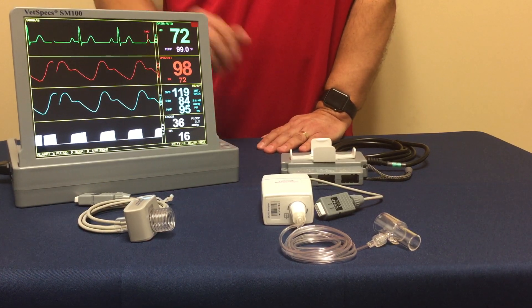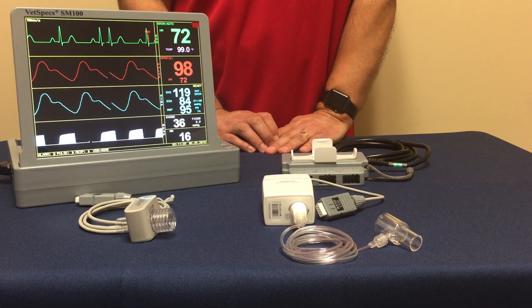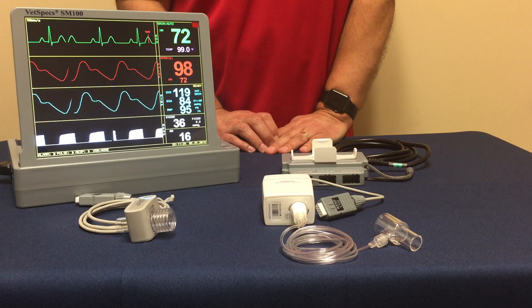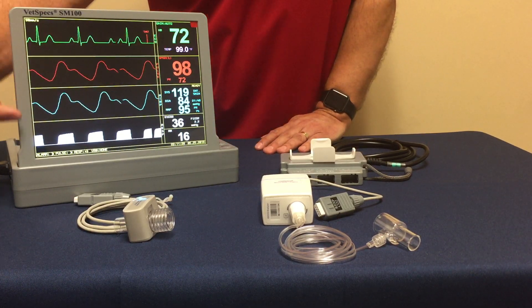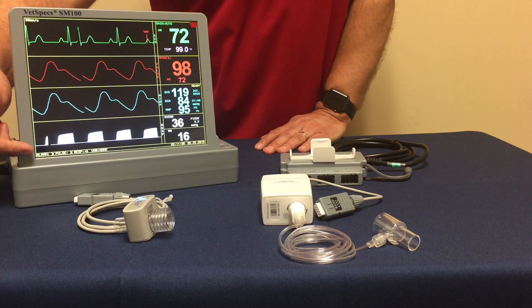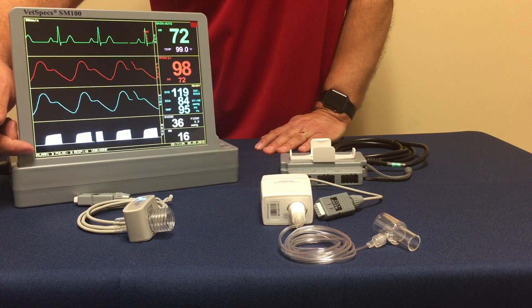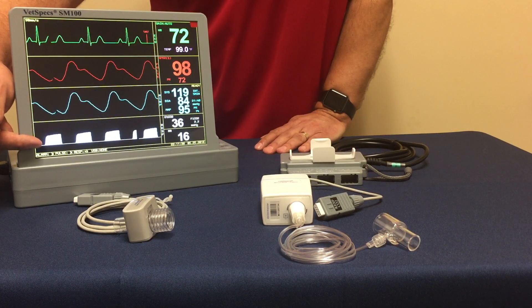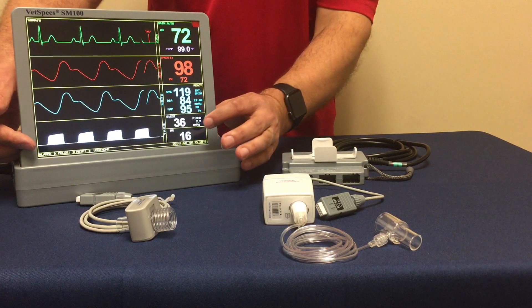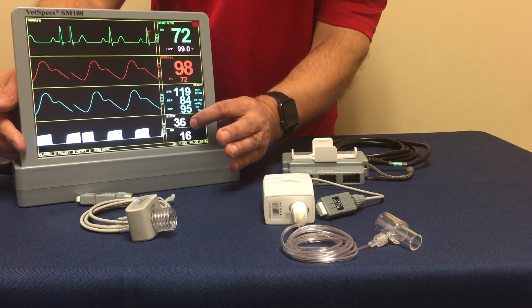In front of you, the monitoring display that you see, this is the latest flagship system by VETSPEX. This is the SM100 model. I'm going to ask you to focus mostly on this bottom waveform, or essentially the fourth channel. The white waveform, of course, is the capnograph.